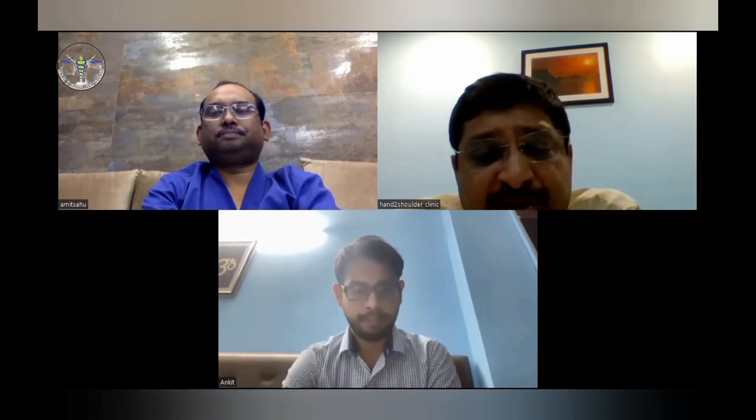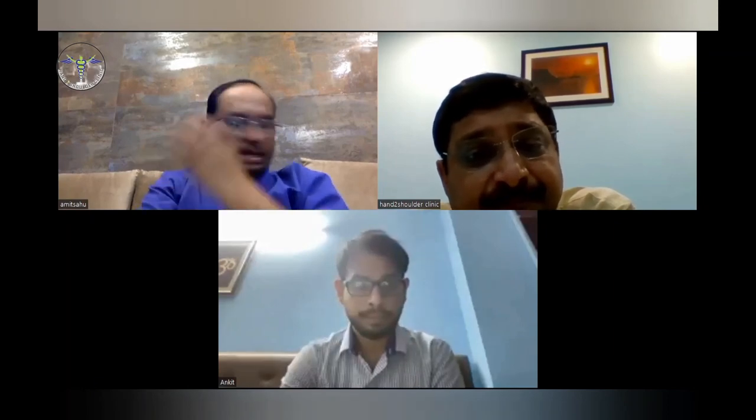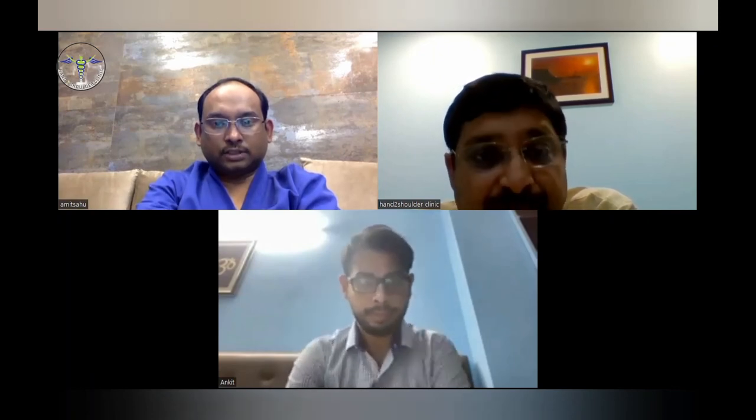So any questions, Ankit? Amit, you want to have any concluding remarks? Most welcome. So as I just told, for the imaging aspect, once we have diagnosed that it is a Hill-Sachs or a Bankart, we should definitely give the dimensions, talk of engaging, non-engaging, on track, off track. We should always try to see if there is a history of instability. If we are still not getting any finding, we should try to search for small Hill-Sachs, small Bankarts. That should not be missed.